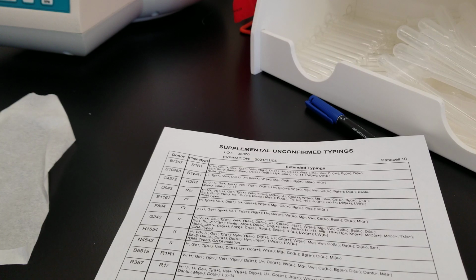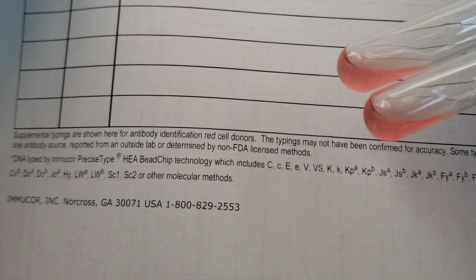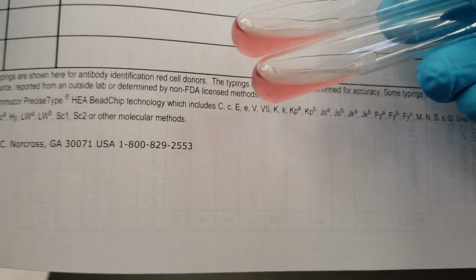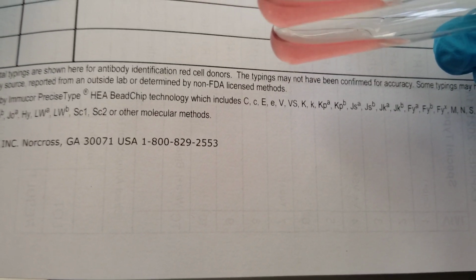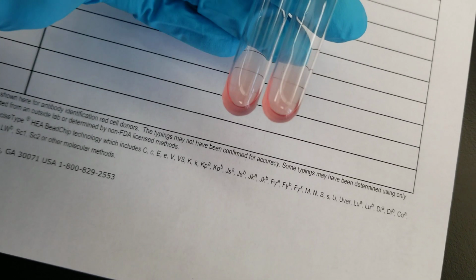So with Kell, you may see a lower reactivity, or a reactivity at lower dilution factors, because this, I would say, is weak, if you look at that. And weak doesn't count, okay? So I don't know how well you can see that. So weak doesn't count.